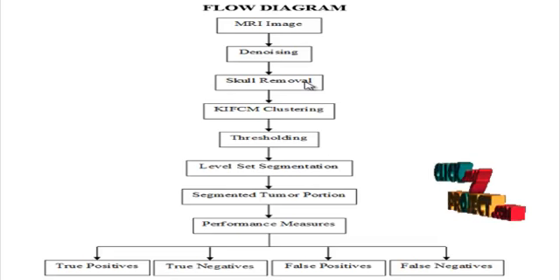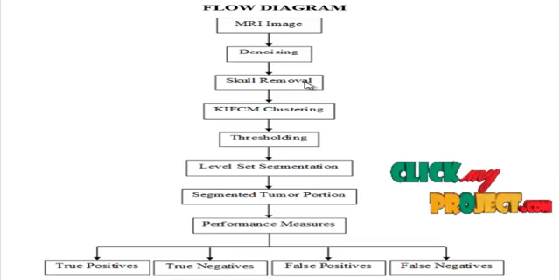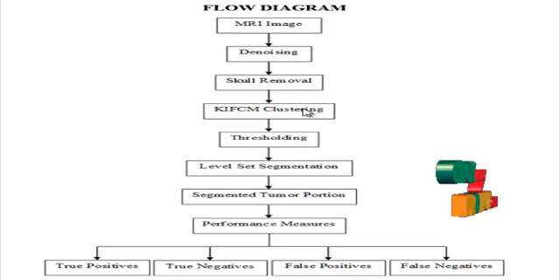The pattern of ones and zeros specifies the shape of the structuring element. The closing of the image by a structuring element is a dilation followed by erosion. The opening by a structuring element is erosion followed by a dilation process.